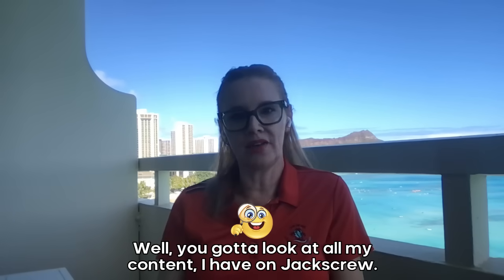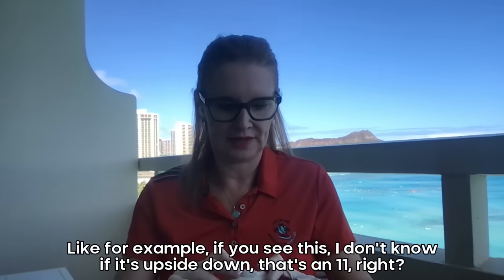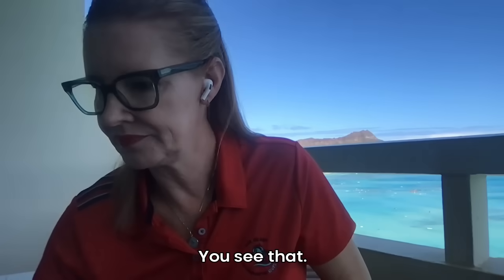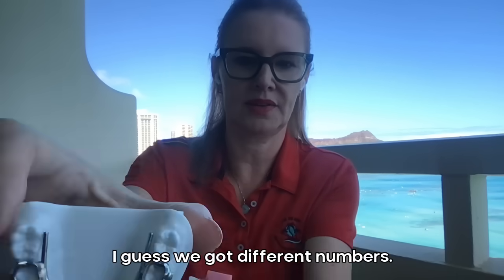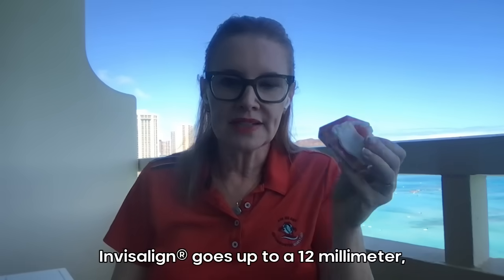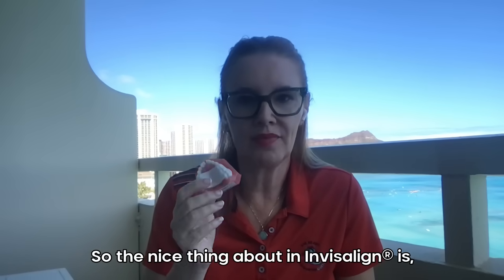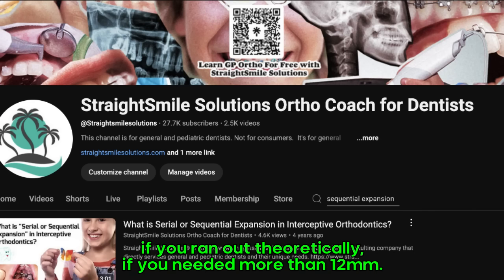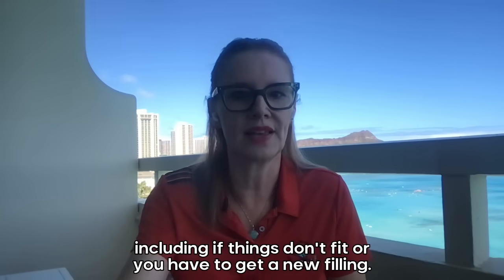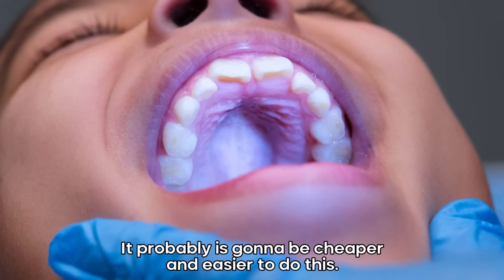Sometimes you need more than one expander. Look at my content on jackscrew sizes. There's generally 7s, 9s, 11s, and there might be some 13s. Invisalign goes up to 12mm, although they say you get more than you would with a regular screw. The nice thing about Invisalign is if you need more than 12mm, you could order more — it's all going to be included. Whatever you need is included, including if things don't fit or you have to get a new filling. Think about all the things that can happen, especially on a very constricted, vaulted palate case. It probably is going to be cheaper and easier to do this.